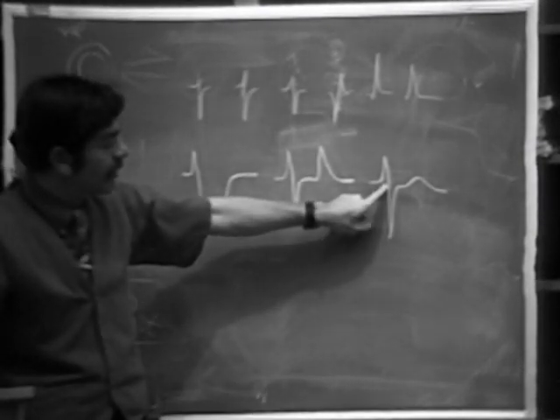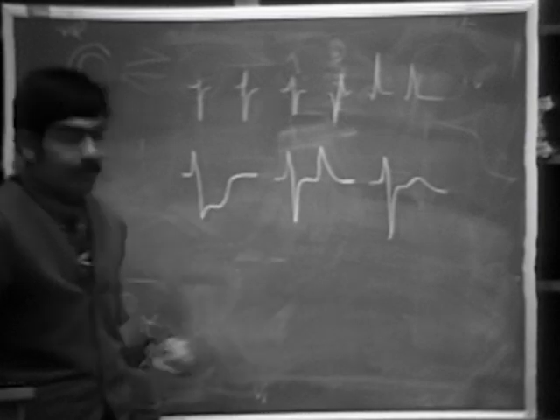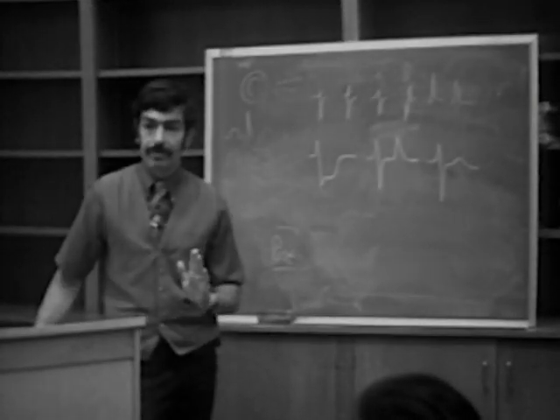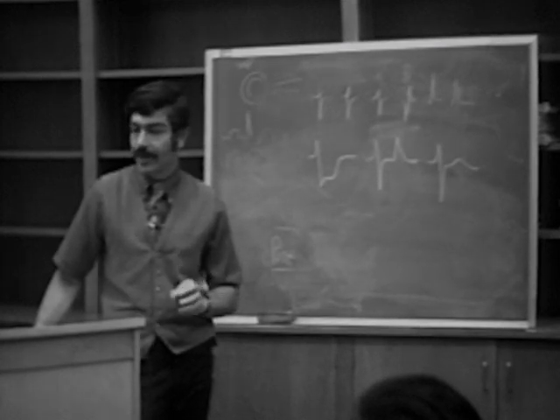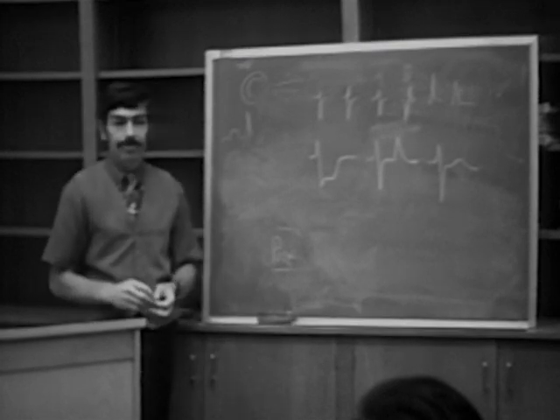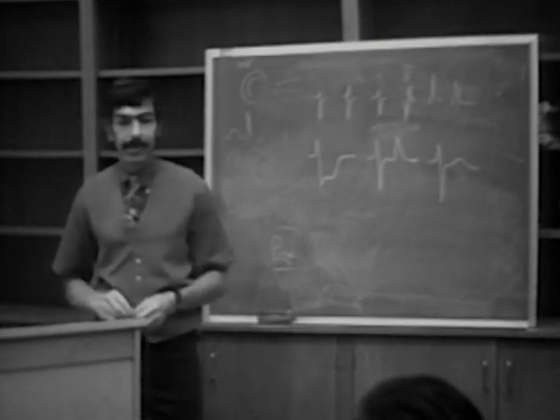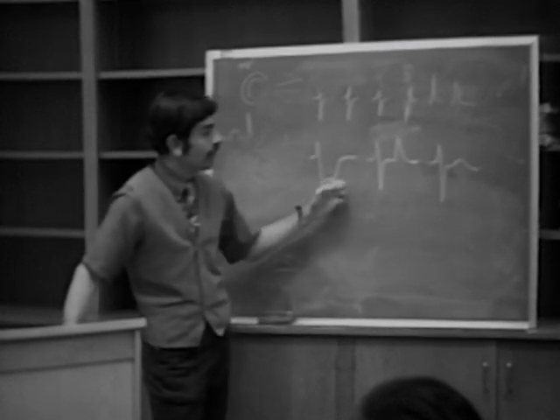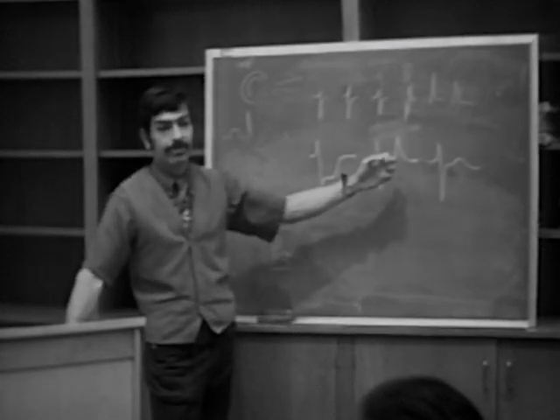How do you differentiate this from right ventricular hypertrophy? And it can be a problem electrocardiographically, and vectors will help you make a definitive diagnosis, though. Differentiating an old true posterior infarct from right ventricular hypertrophy. But if you see the acute situation and you see the evolution, there should be no question.